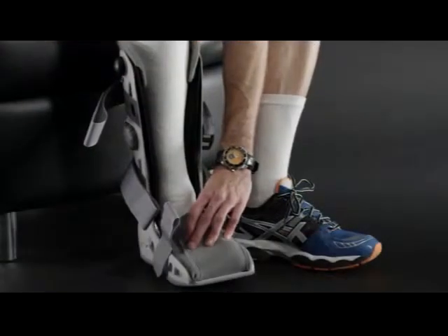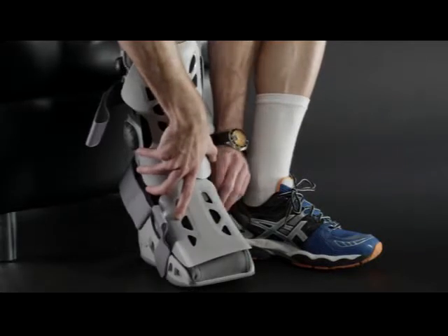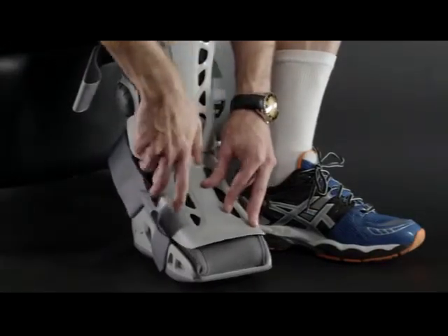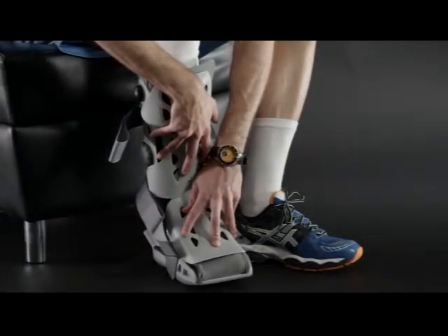Next, replace the front panel. Position the panel so that the AirCast logo is over your toes and the foot panel is situated inside the boot. Secure the upper part of the panel outside of the boot.